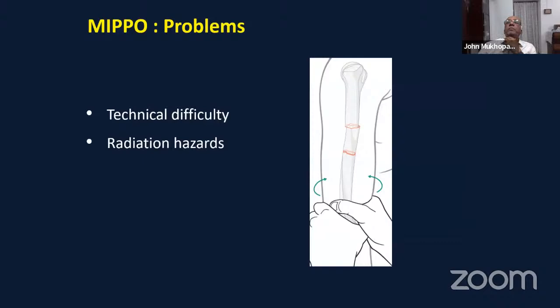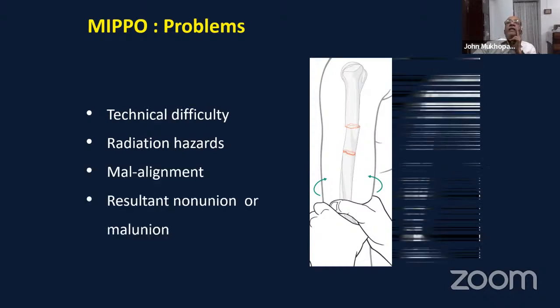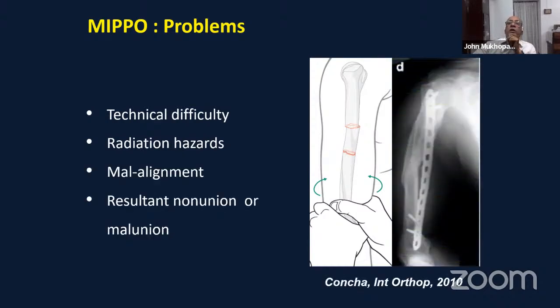There are some problems with MIPPO. It's not that it is very easy to do in every situation. There can be some technical difficulties, and of course, there may be a fair amount of radiation. So you need to try and reduce the use of the image intensifier. And if you get malalignment, you're likely to get non-union or malunion. So it's important to get length and alignment and do it as biologically as possible.